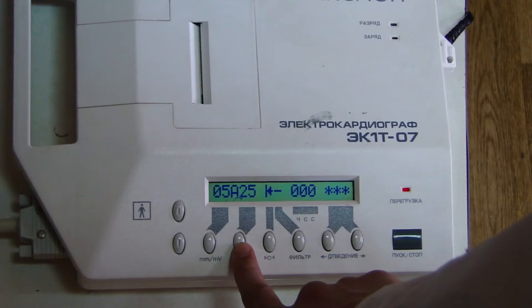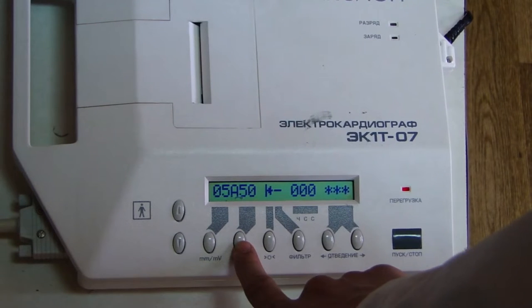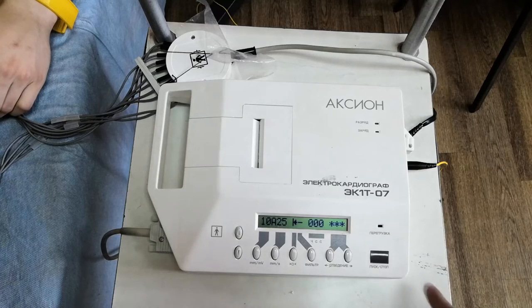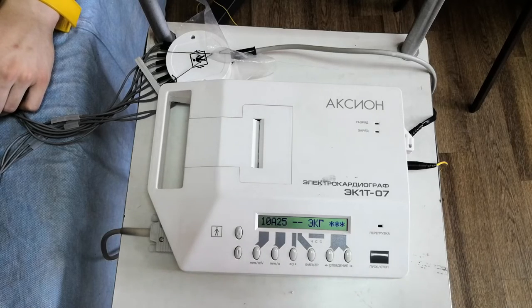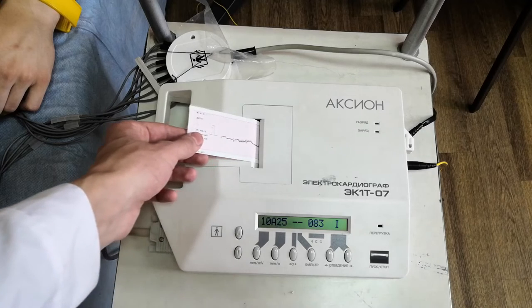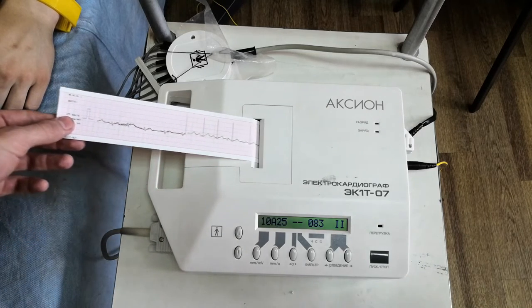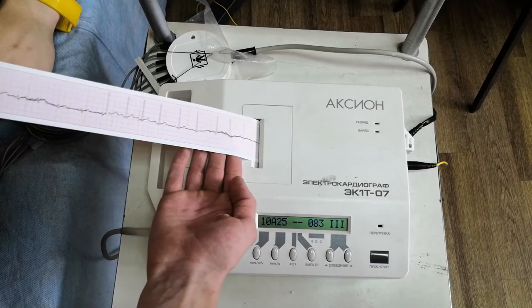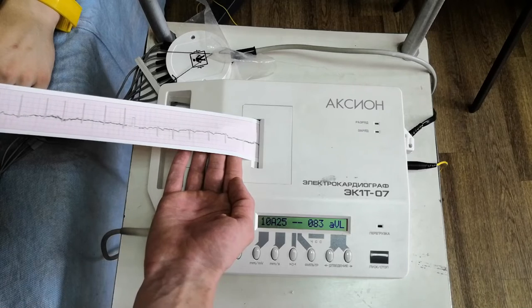The change in amplitude affects the height of the teeth. There are two ECG recording speeds – 25 and 50 millimeters per second. To register, we press the start-stop button. All leads are recorded automatically. In order to start taking an ECG, we ask the patient not to talk, not to move, and to lay still.